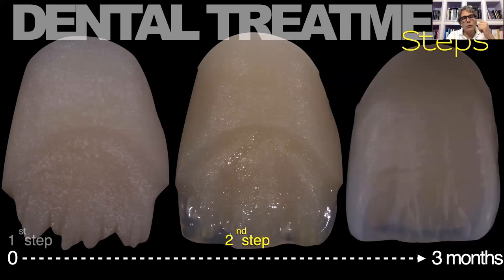With this aim, I am able to modify the incisal edge after its milling, creating some indentations that simulate the dentin mamelon. After that, I can layer different translucent layers of ceramic, rebuilding the incisal edge completely and creating this transparency in which I can show through the incisal edge the shape of the dentin mamelon, giving a more natural appearance to the whole patient's face and to the frontal teeth. That is important when we have to use low translucent materials.